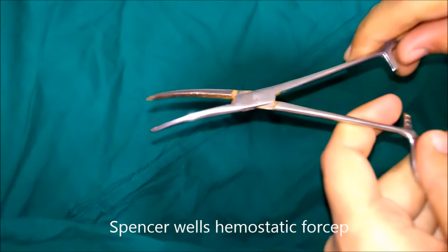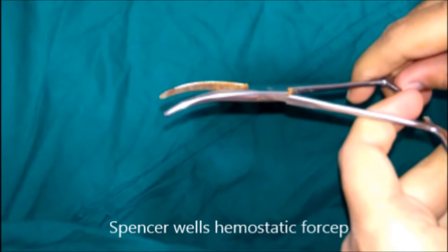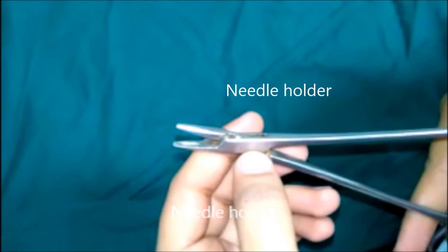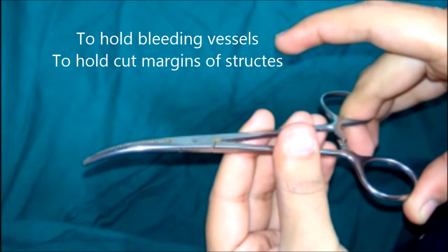These are Spencer Wells haemostatic forceps, commonly known as artery forceps. The blades are provided with transverse serrations and the tips are conical and non-toothed. To differentiate from a needle holder: the needle holder is a relatively heavier instrument, its blades have criss-cross serrations, and there is a groove in the center. Artery forceps are used to hold bleeding vessels while cutting through tissue layers, or to hold cut margins of structures during abdominal incision or closure.